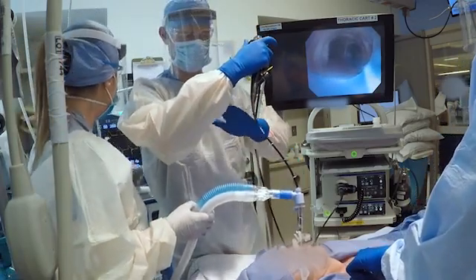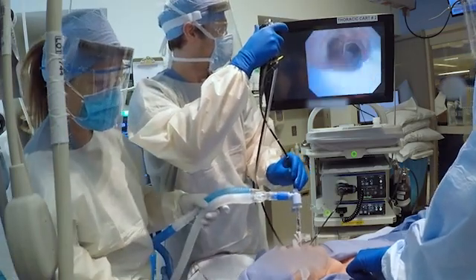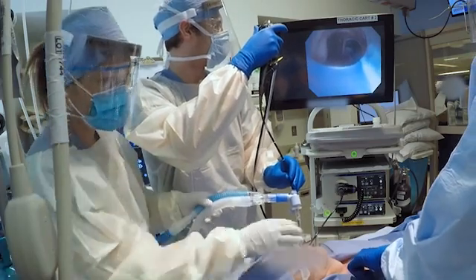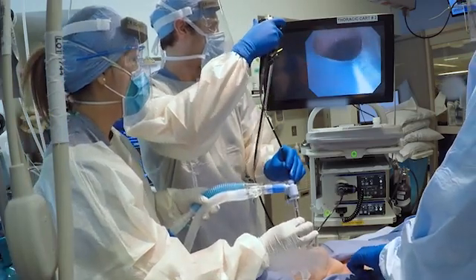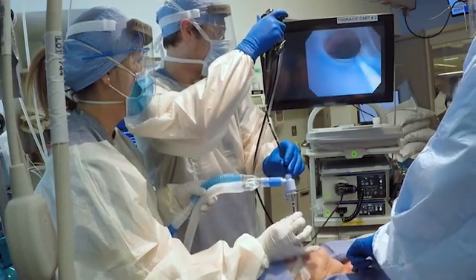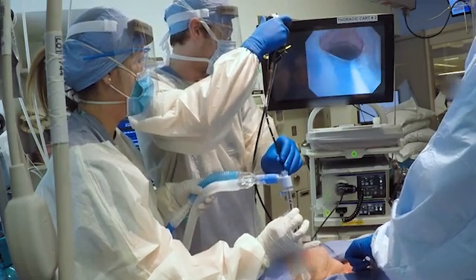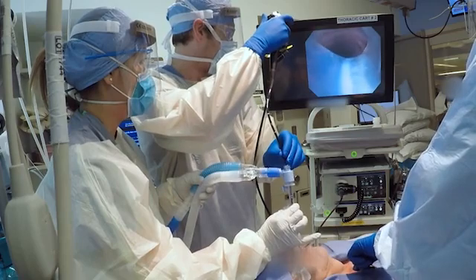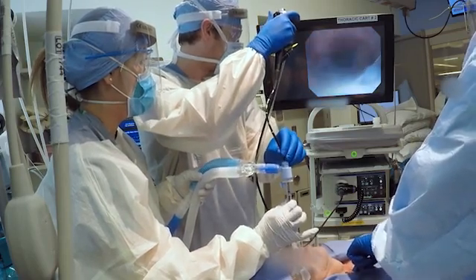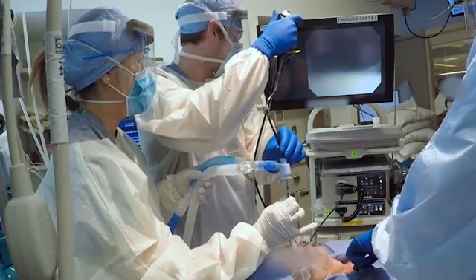The respiratory therapist deflates the oral endotracheal tube cuff. The respiratory therapist and the bronchoscopist together then slowly withdraw the oral endotracheal tube and bronchoscope simultaneously until the subglottic landmarks are visible. Palpation of the anterior trachea by the surgeon can facilitate identification of these landmarks. The bronchoscope is kept within the oral endotracheal tube at all times to ensure control of the airway. Precise communication and coordinated movements between the respiratory therapist and bronchoscopist are crucial to prevent accidental extubation.